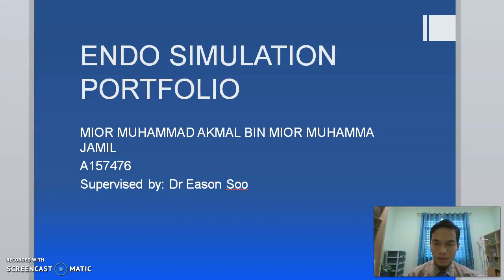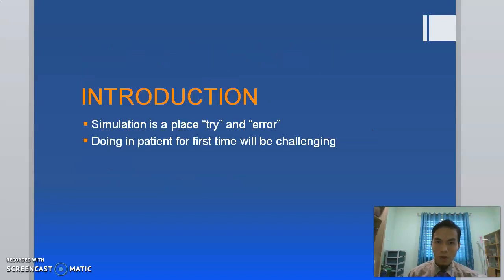And today I would like to present my endodontic simulation portfolio. As we all know, the endodontic simulation gives us many opportunities to get guidance before we do it in our clinic. So it's a place where we can make any error, and the doctors will guide us and give us many tips. And we all know that as a clinician, we must be able to provide an ear-to-ear image towards the patient.